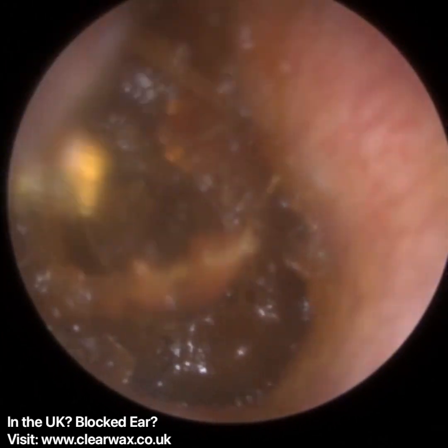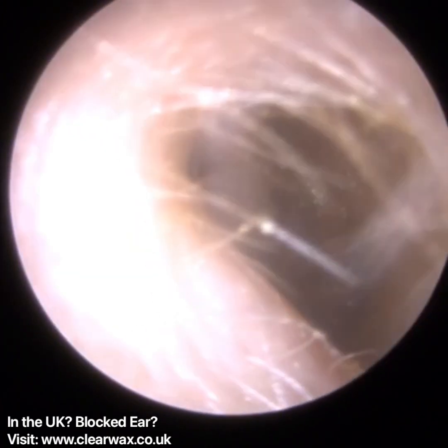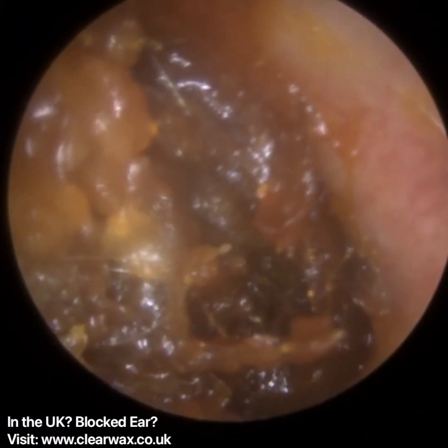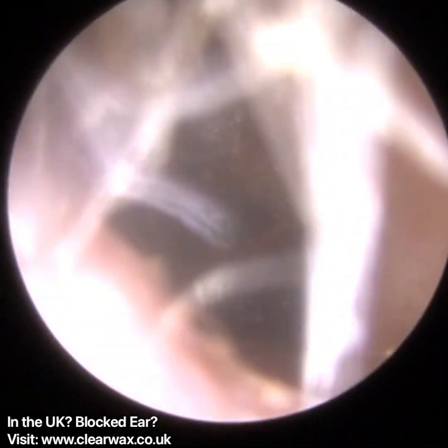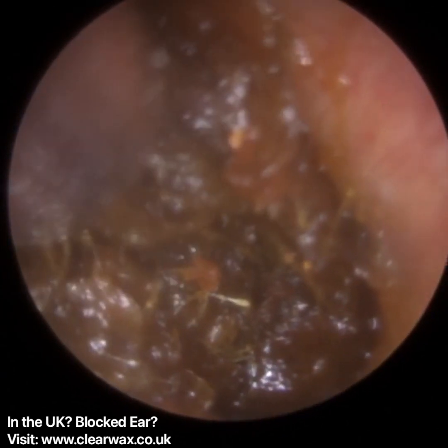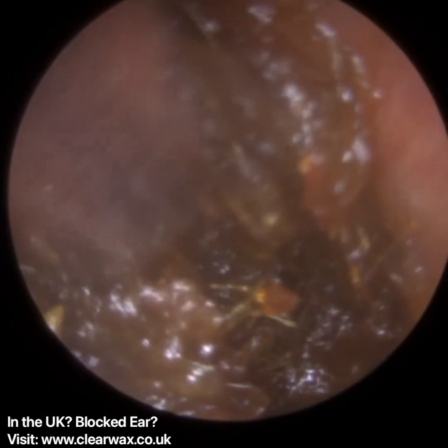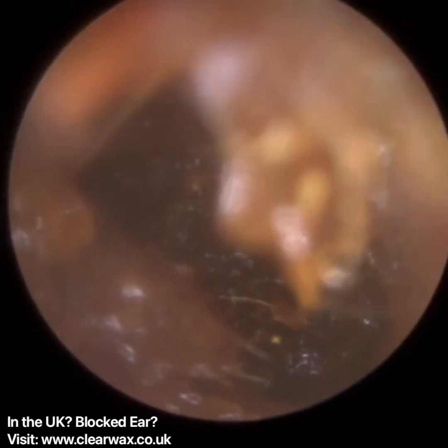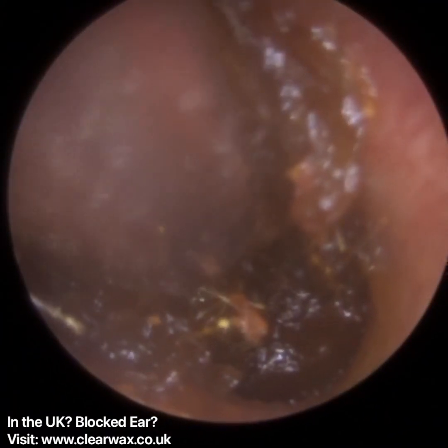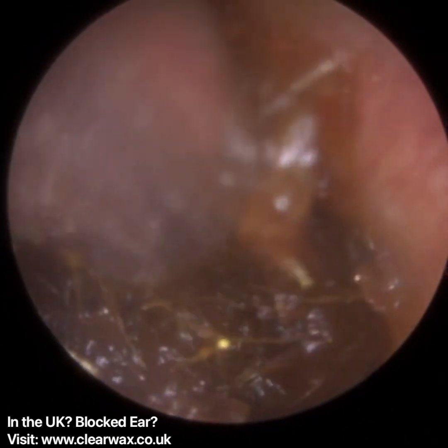She was just very open and honest, and she explained to the patient that she doesn't feel comfortable attempting to remove because she can't really gain access and the view's not very good with their system. So they used a different visualization system than myself. I've used the iClearscope, the wireless endoscope that I've developed under my other company called Clearwax, and this audiologist was using a different visualization system, which is not going to be up to the job for these kind of cases. And the audiologist advised the patient to contact myself.